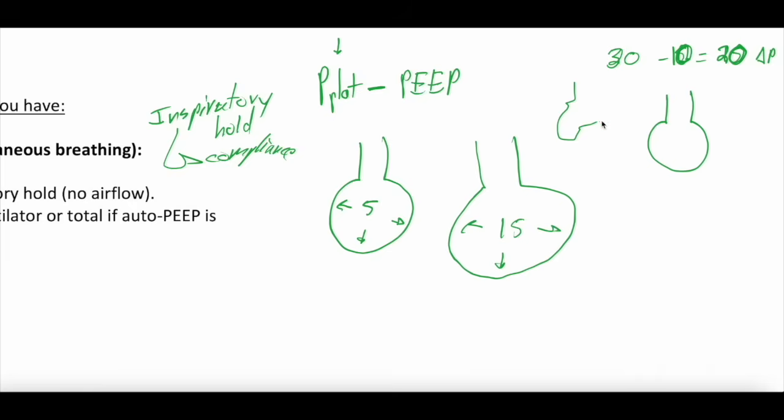I think this alveolus is kind of collapsed down and they're under distended. So what I'm saying is, I think if I go up on the PEEP, that will cause the alveolus to be perfectly distended, which means that the plateau pressure won't really change, because I'm just going from kind of an underdistended, shriveled down alveolus to a normally distended alveolus.